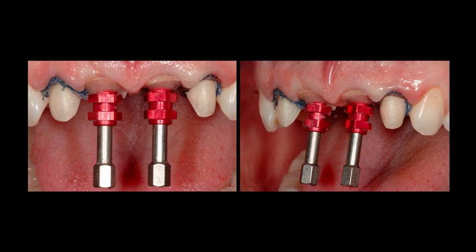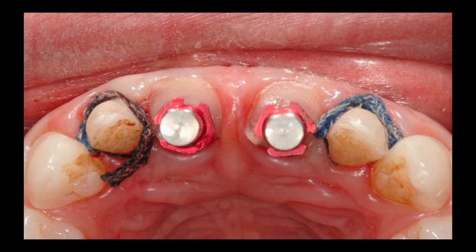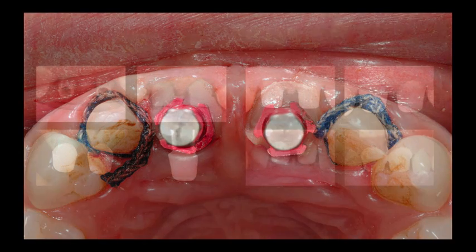So it's a pretty simple technique, but it adds to the aesthetic outcome of your case. You can see how nicely the tissue's being supported by this transfer. Very similar to the way it's supported by the provisional crowns. Here's another view. You can see the tissue between the two transfers is peaked, has a little peak between it like a papilla, like it is with the provisional crowns.